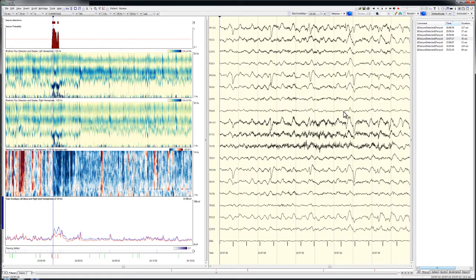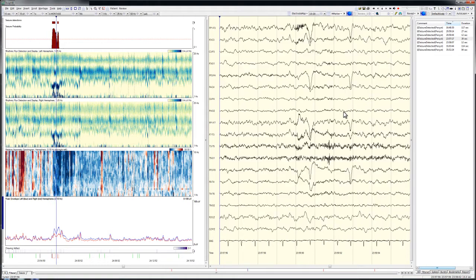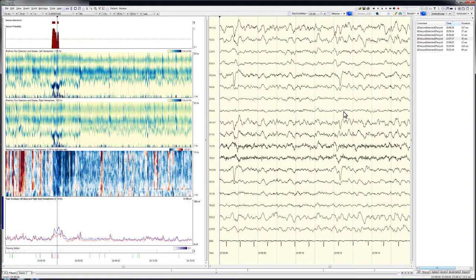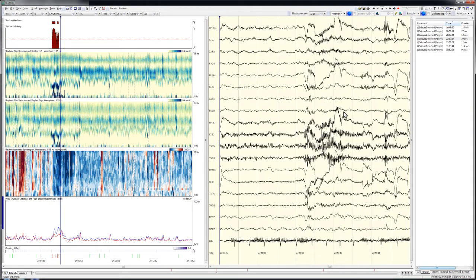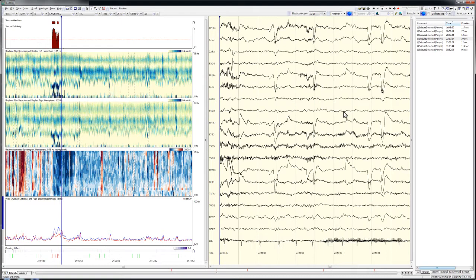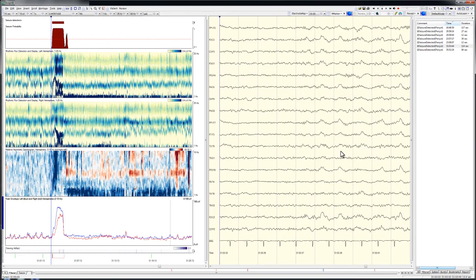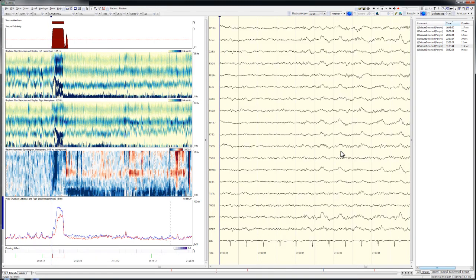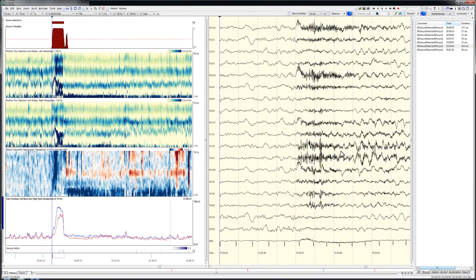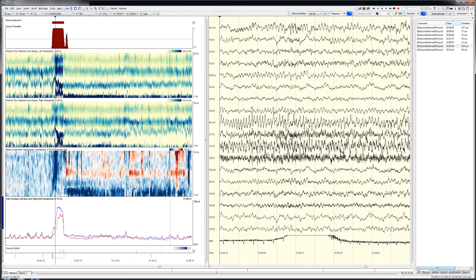By clicking on the remaining detections in the list, I'm able to rapidly confirm that five seizures were correctly detected by the algorithm. There were no false positives. This took me two minutes to review, and the detected seizures corresponded to the five seizures identified by the expert during full record review.